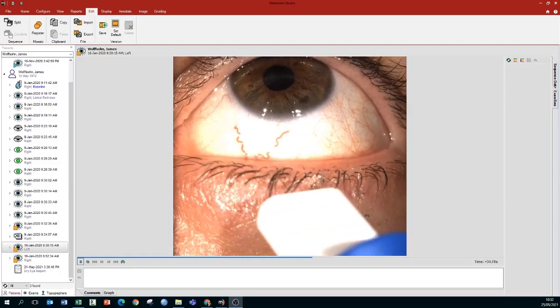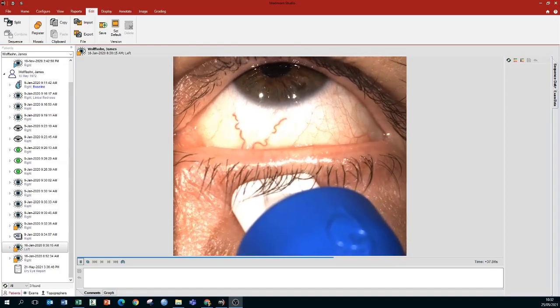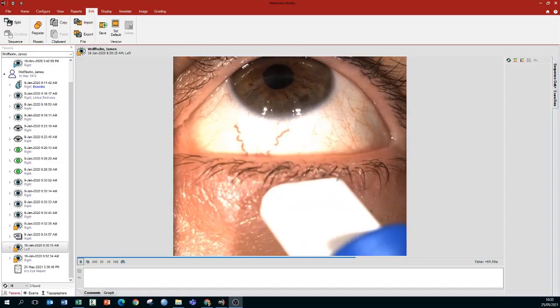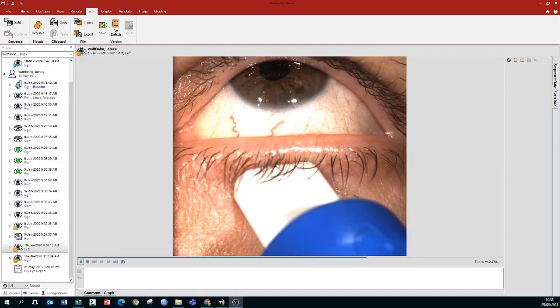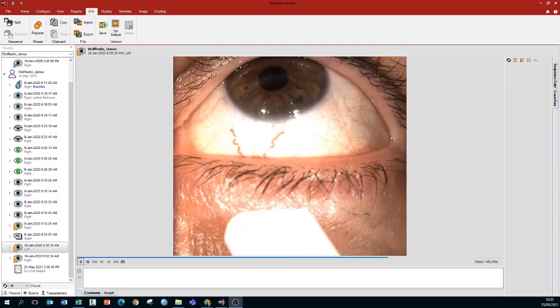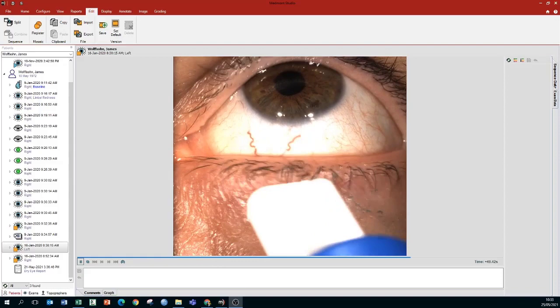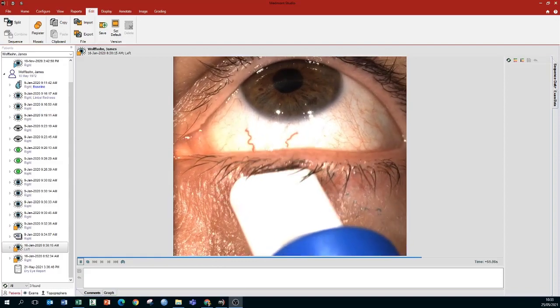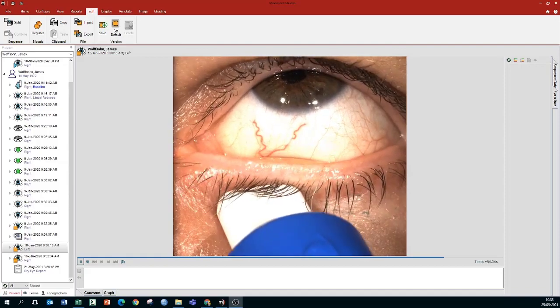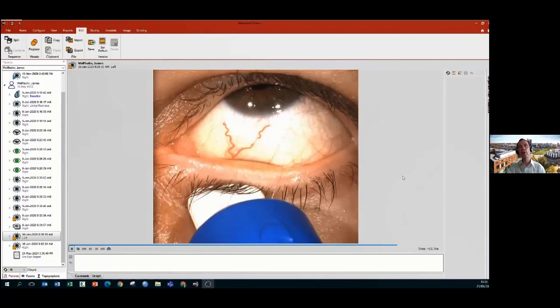Of course, at this point, they're staring up and something strange is pressing the eye, so they can understand the testing better and why we're recommending a particular type of management. So really powerful. We're doing a little bit more than we would do normally here. We would normally do three presses, central, nasal and temporal, to see how the glands are expressed with that. So really powerful, that sort of imaging technology that allows us to see that.